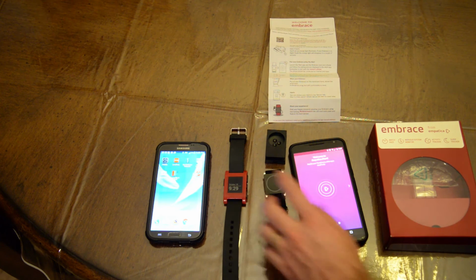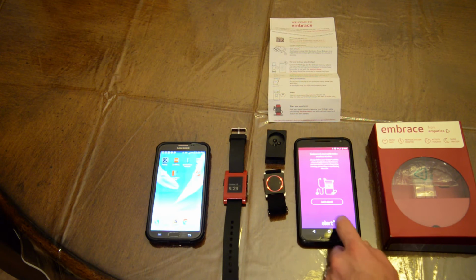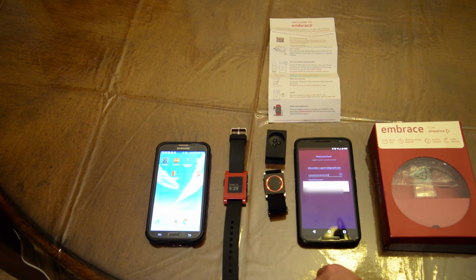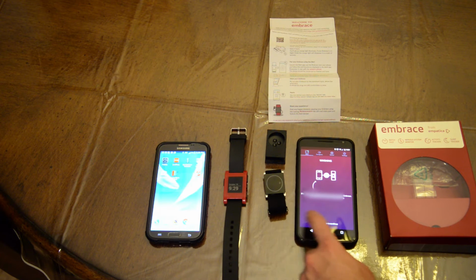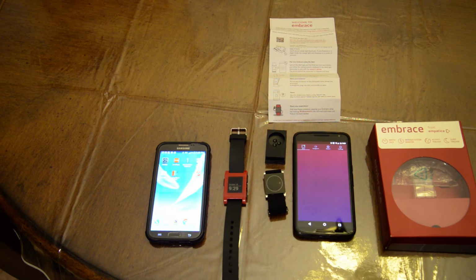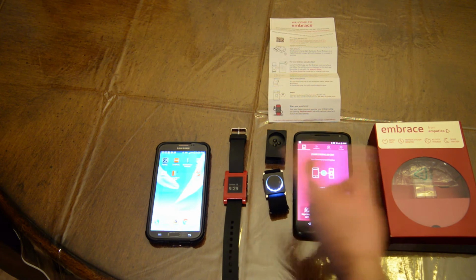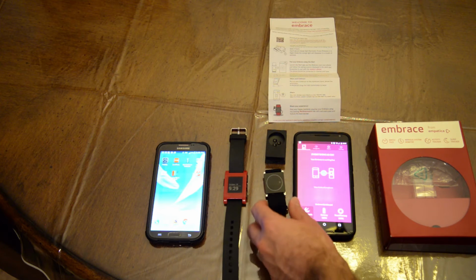Once you have charged it, you're ready to connect your account. It's pretty simple. You just swipe, follow the directions. Let's start. Log in. Once it logs in, it's going to show you examples on how to use it. It has a very nice GUI, and it's pretty simple to use. You would want to allow pretty much anything. As you saw, the little happy face is immediately connected. That's good. Once it is connected, you're pretty much set and done.